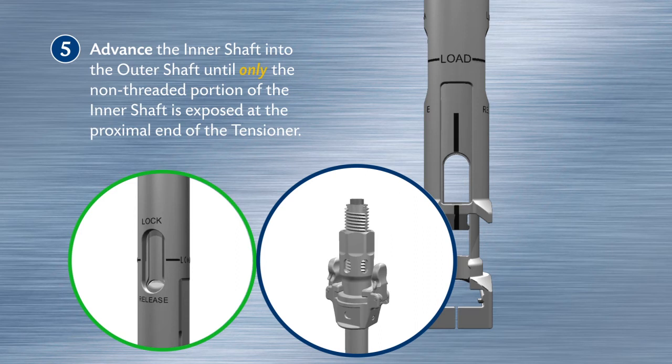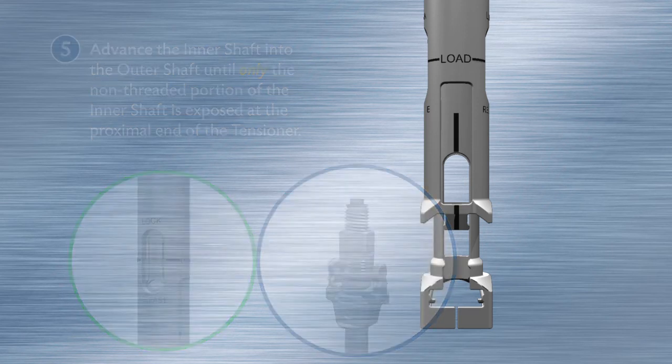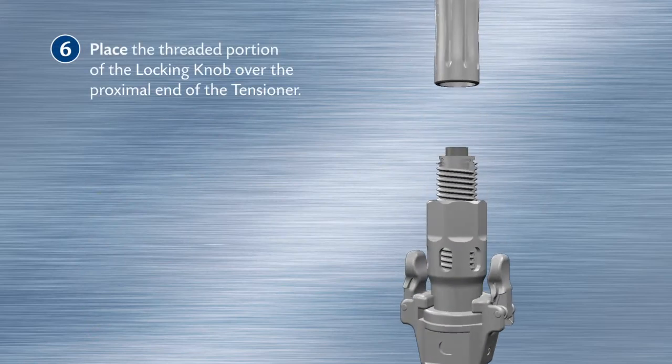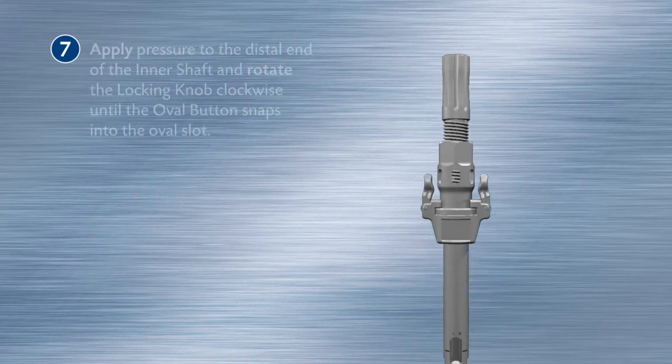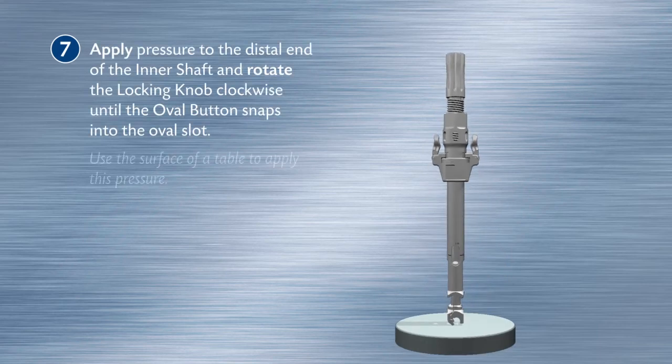Place the threaded portion of the locking knob over the proximal end of the tensioner. Apply pressure to the distal end of the inner shaft and rotate the locking knob clockwise until the oval button snaps into the oval slot.